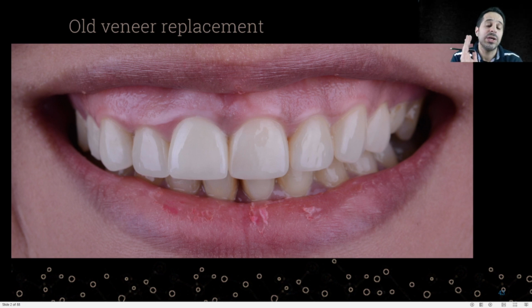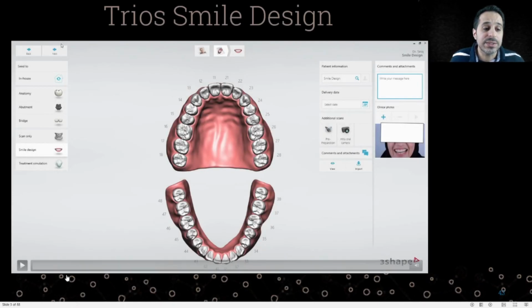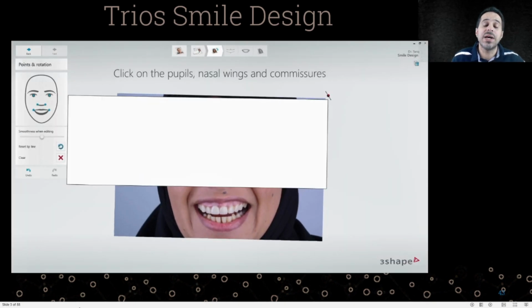the second way, just utilize the technology and use the advanced way to convince your patient to go for the treatment and to better communicate between you and your lab and also between you and your patient. So in this case, what we are willing to do, just get for her a simple photo and you can start doing the DSD, the smile design.